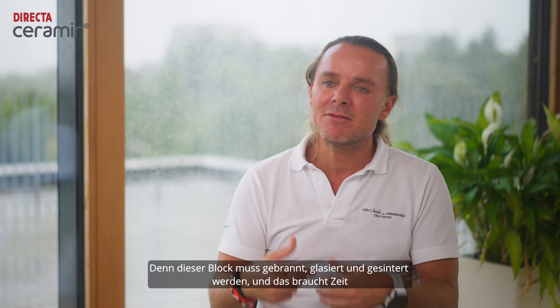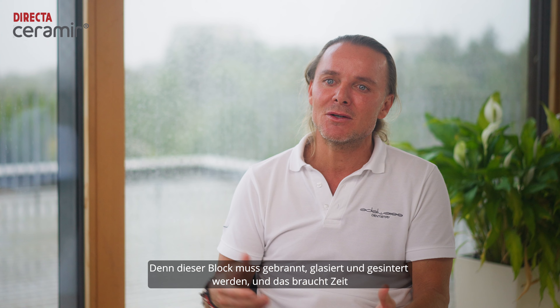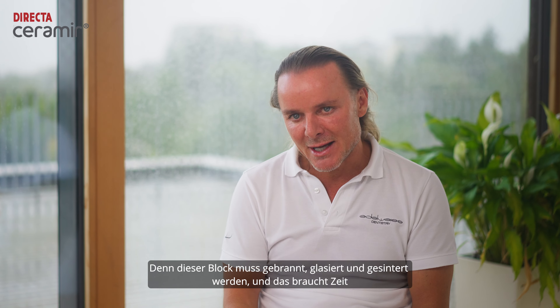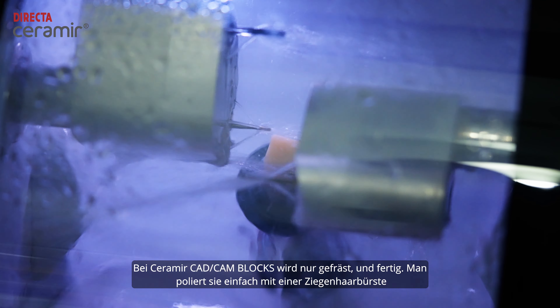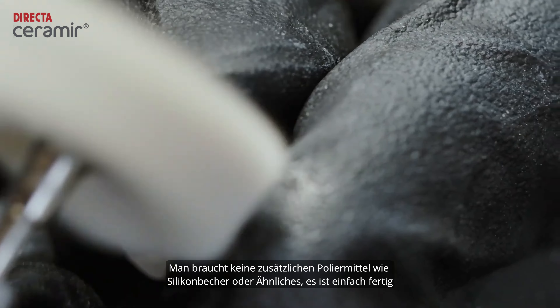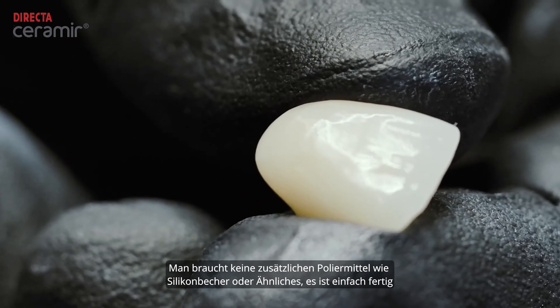Because that one I have to burn, I have to glaze it, sinter it, and that takes time. With the Ceramir CAD CAM block, you mill it and it's done. You just polish it with a goat hair brush. You don't need additional polishes like silicon cups or anything like that — it's just finished.